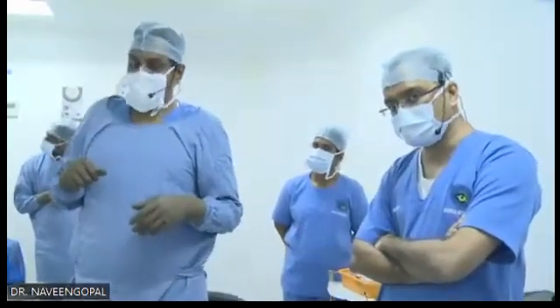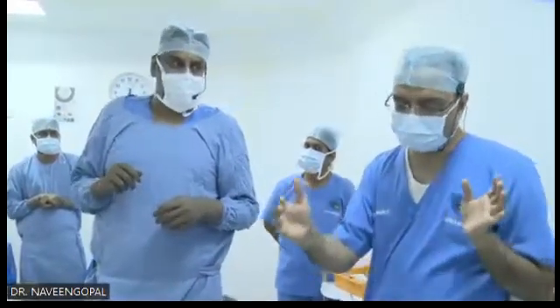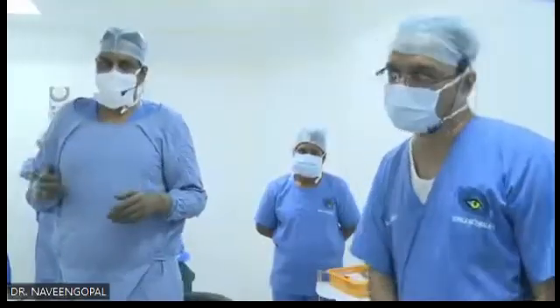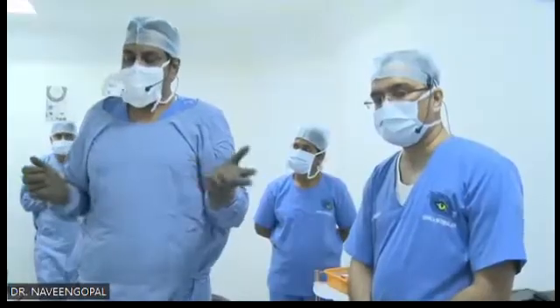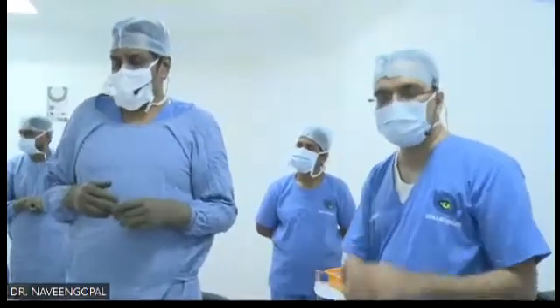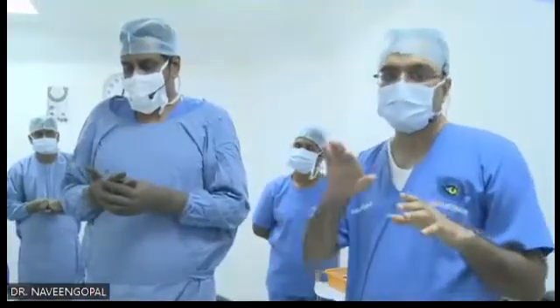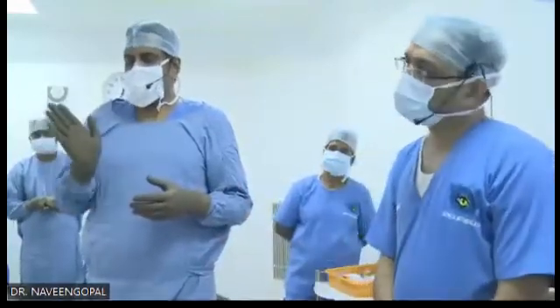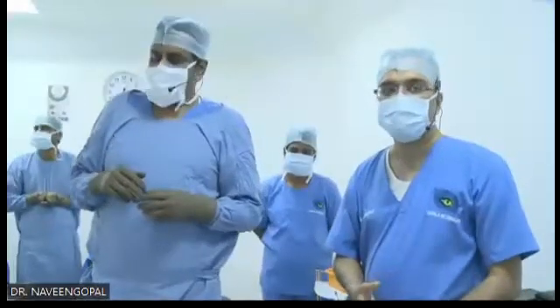One more advantage is that with Indian phakic lenses, the range of refractive power you get is much more than the star ICL. You can customize it. 19 is the final thing you get in star ICL; you go up to 21. If you don't want to rotate any toric phakic lenses, you can ask the company to give a customized lens where the toricity is well maintained and you can place the lens horizontally only. If you put it at 180 degrees, they will do the toricity in that manner. But customized takes time, 15 days minimum.